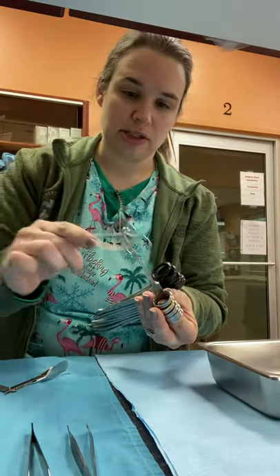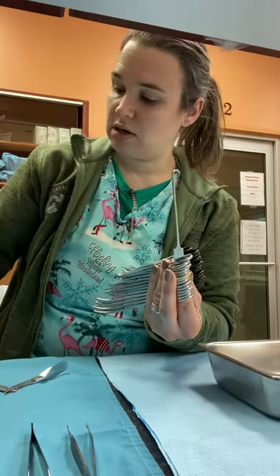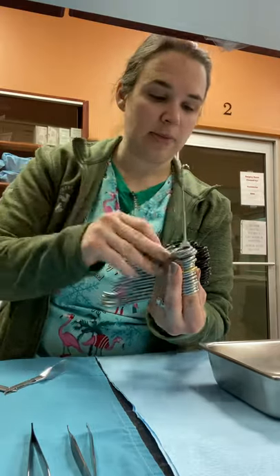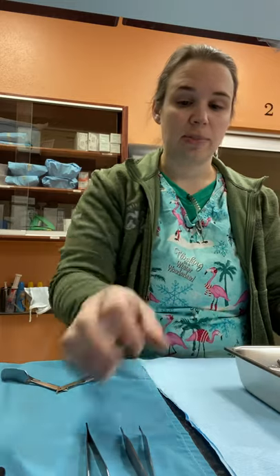Once we get all these on our spay hook for our general surgery pack, we will place them in our stainless steel tray, like such.